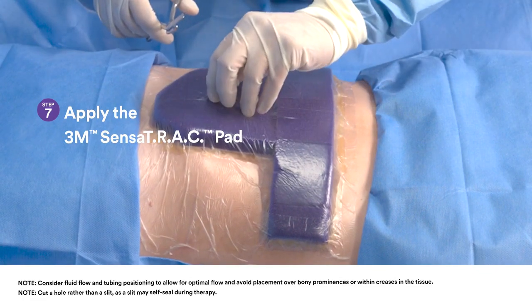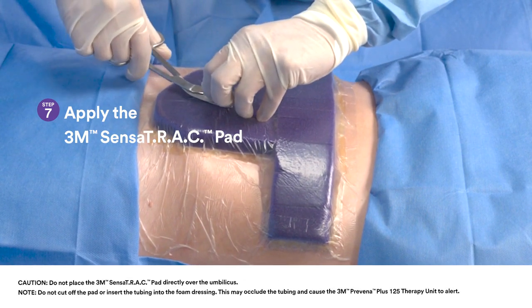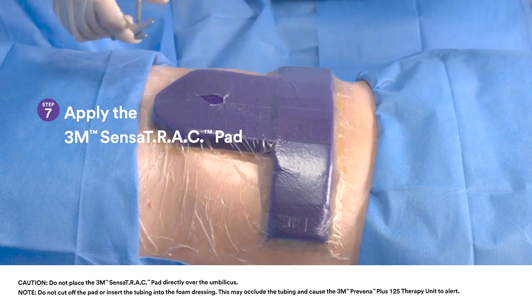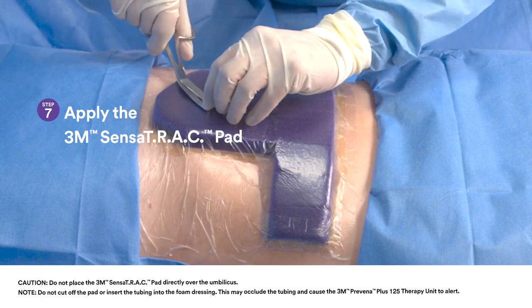Choose pad application site. Pinch drape and carefully cut an approximately 2.5 cm hole through the drape. The hole should be large enough to allow for removal of fluid and exudate. It is not necessary to cut into the foam.